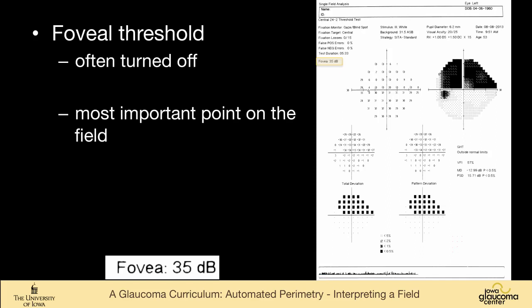As we go through the field, the foveal threshold, that's often turned off in some perimeters. It's an option to have it on or off. You can see 35 decibels. Really honestly, it's the most important point in this person's field is what their foveal threshold is.